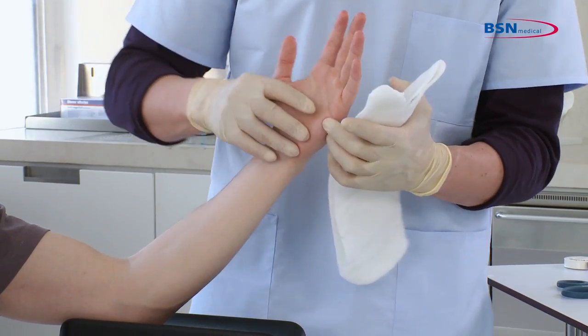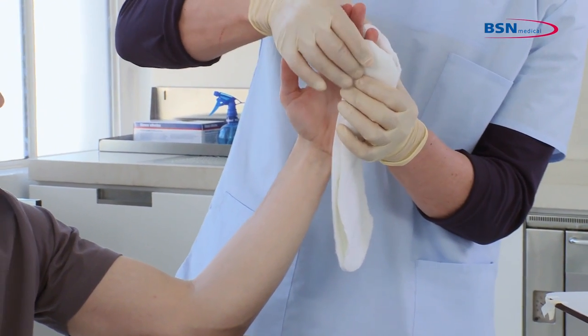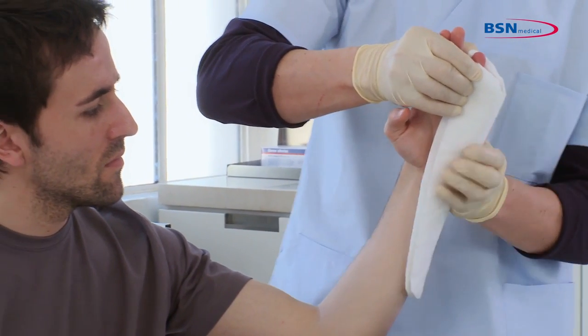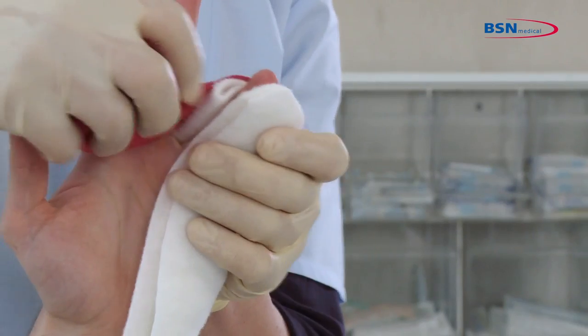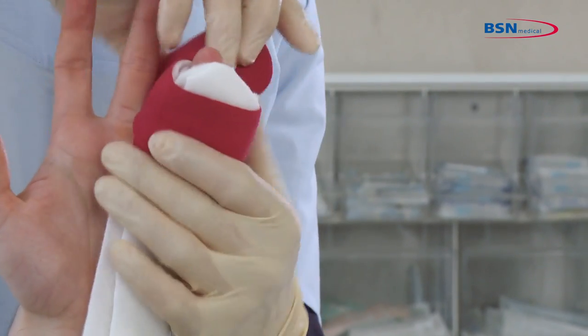Start at the tip of the fifth finger, creating a gutter. Hold the splint around the fourth and fifth finger and fold it around the arm. To secure the splint, wrap a bandage around it. Start wrapping around the fourth and fifth finger two times and also continue around the wrist twice.